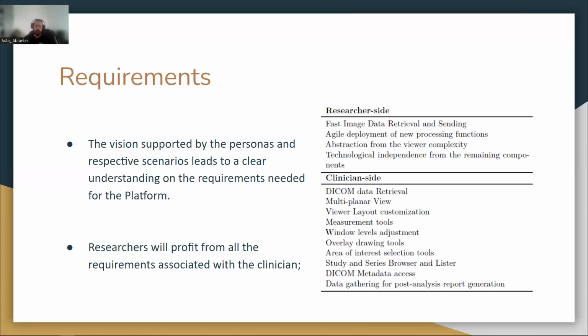Since one major goal for the platform is to be extensible and dynamic, having a modular approach is paramount, since each component can be developed independently. And this is a major concern because it grants a higher consistency to the system as a whole. So if a new processing methodology is needed or developed and it needs to be tested, it can be easily added to the features faster by creating a new service or modifying an existing one without major compromises to the whole project.